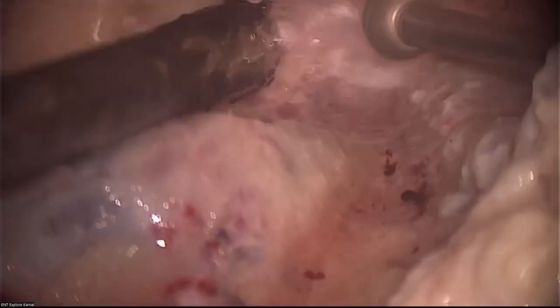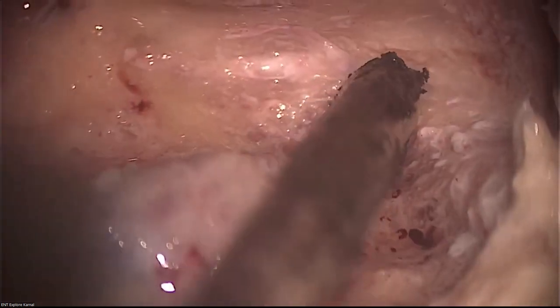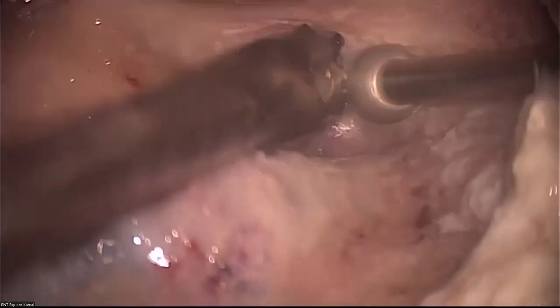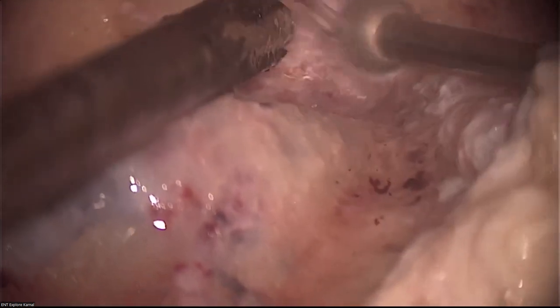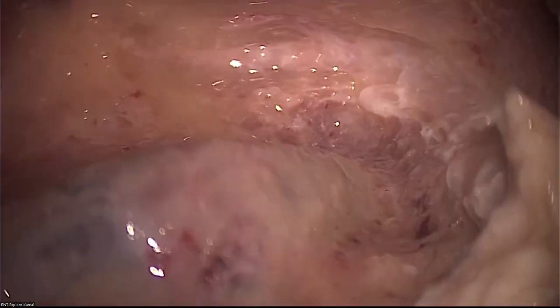Now, let me show this relationship better. Can you see the chorda arising from the facial nerve? Yes, very clear. And this facial nerve, see this digastric ridge and the facial nerve relationship. This is the digastric ridge and this is the facial nerve immediately medial to it. Can you see? Very clear.